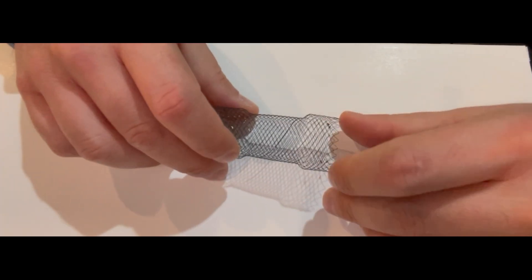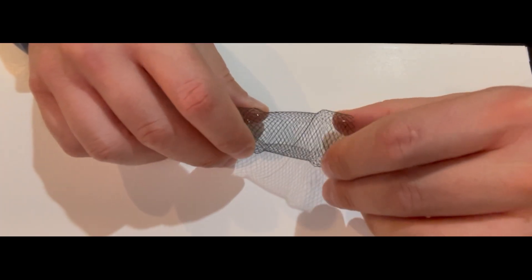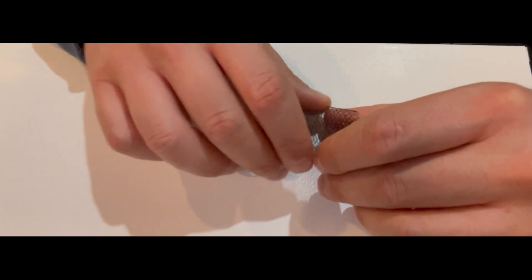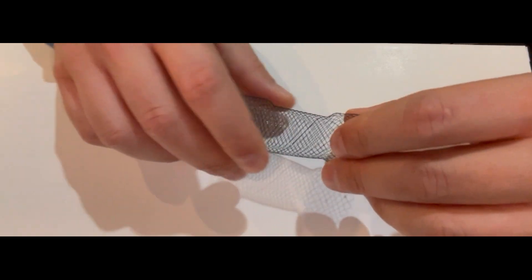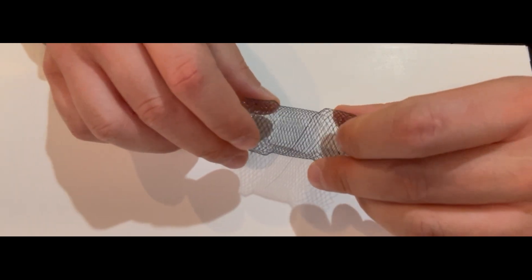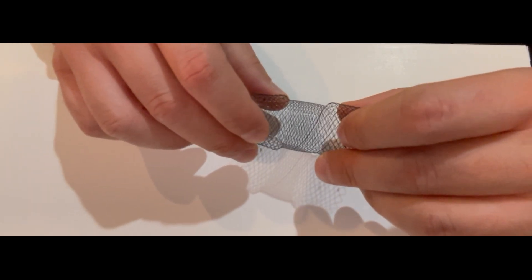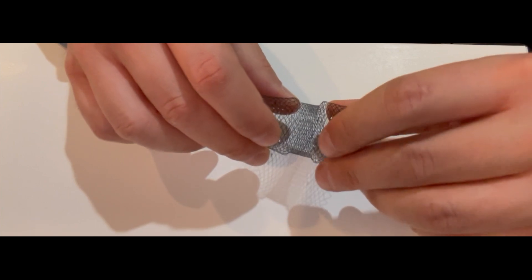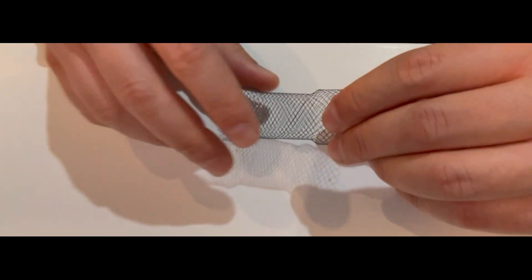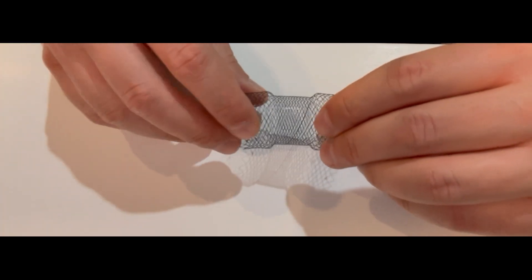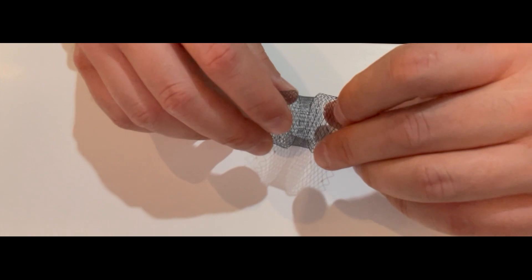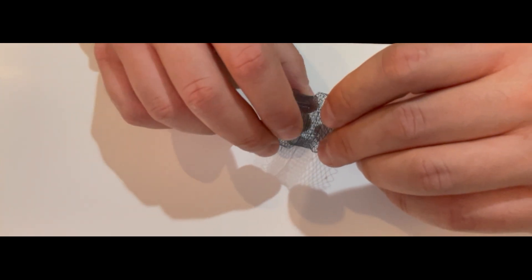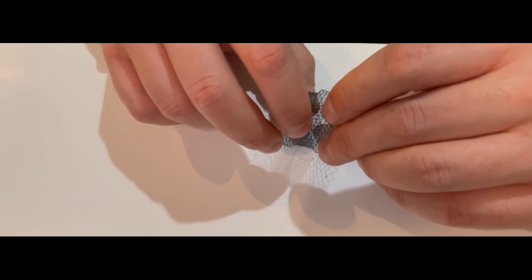The reason I like this stent is that it's self-expanding and stackable, similar to a Supra stent. You can deploy it in a stacked fashion, which increases its resistance to compression.